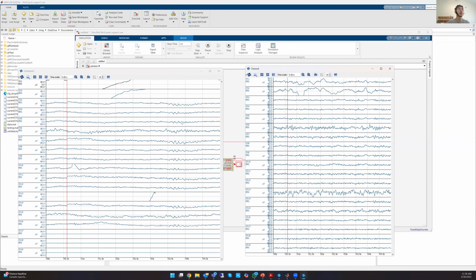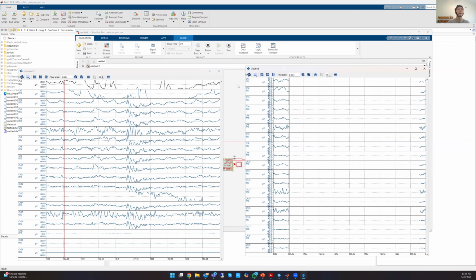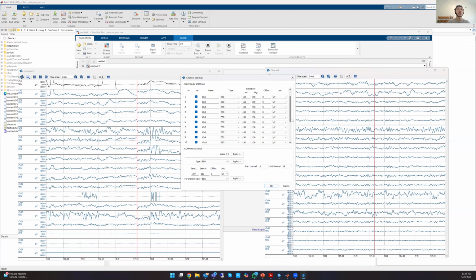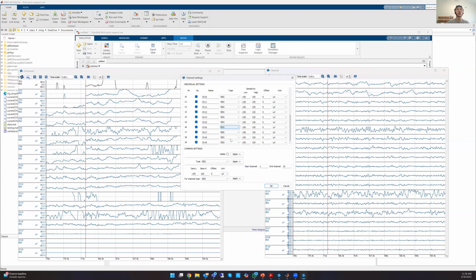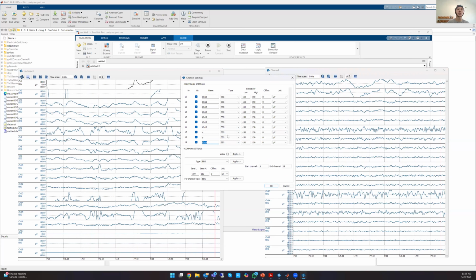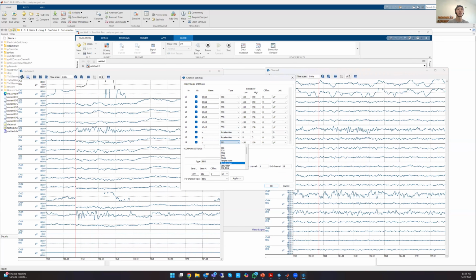Okay, on the left-hand side is the unclean signal. On the right-hand side, after OSCAR. Let me see the scale again. So if I click on this, it's channel settings. Channel number 1 to 16 are actually EEG signals. Channel 17, 18, and 19, remember, I take the acceleration scope, so it's actually g.HIsys acceleration data. You can refine it here and rename the channel numbers here.